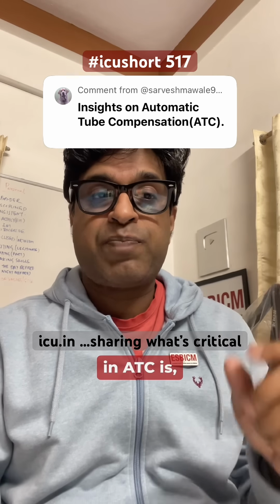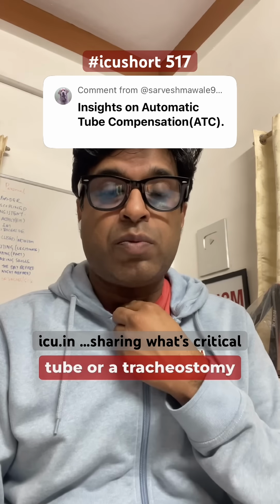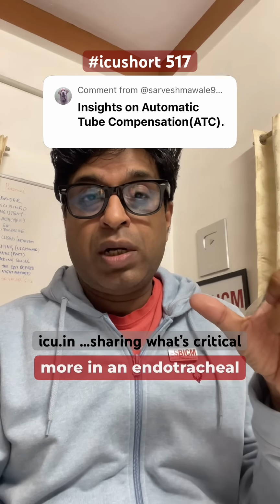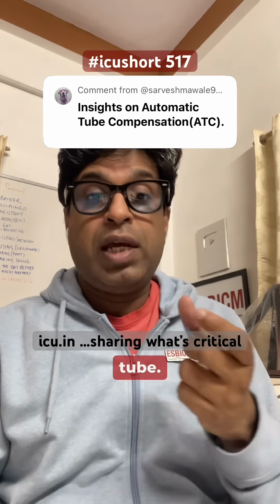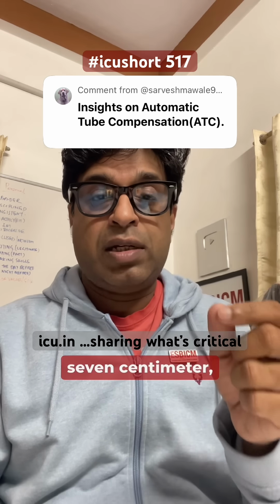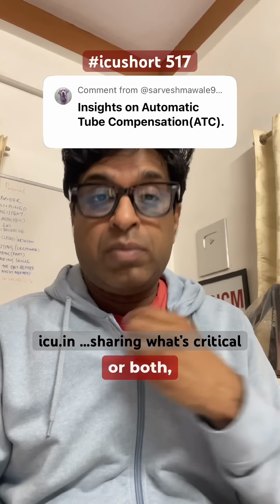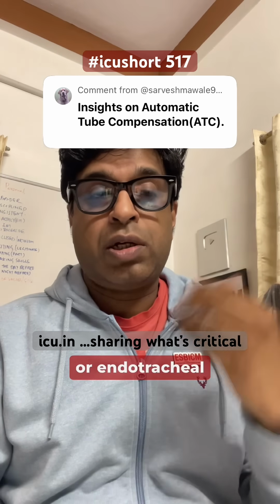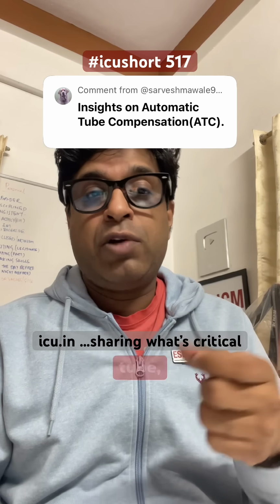in ATC? One is the tube size, whether the patient has an endotracheal tube or a tracheostomy tube. The pressure will be required more in an endotracheal tube, and less in a tracheostomy tube. Then, which size of the tube it is, whether it's 7 mm, 8 mm or 9 mm, and whether tracheostomy or endotracheal tube. Because if it is a narrow tube, more pressure is required. If it's a wider tube, less pressure is required.